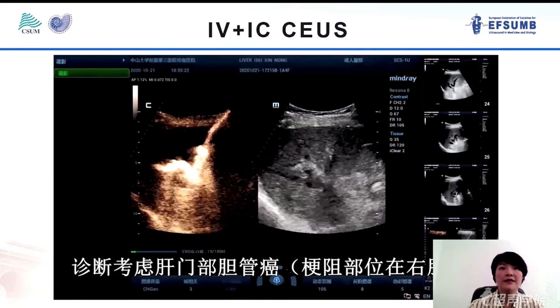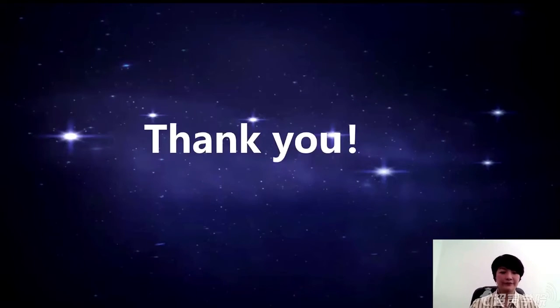That's all. This case showed how to perform the intravenous and intracavity CEUS examination, and how we can detect hilar bile duct cancer and its obstruction level. That's all. Thank you.